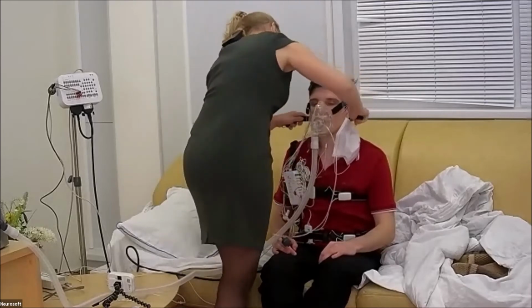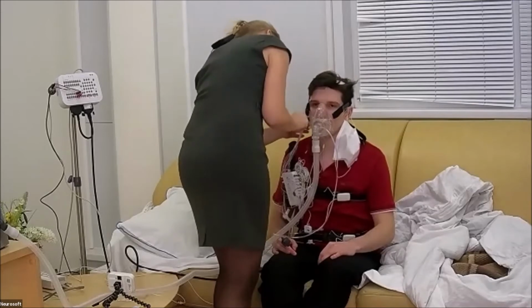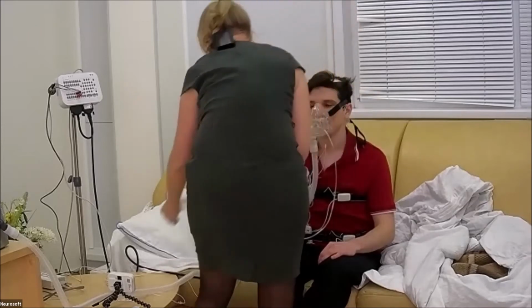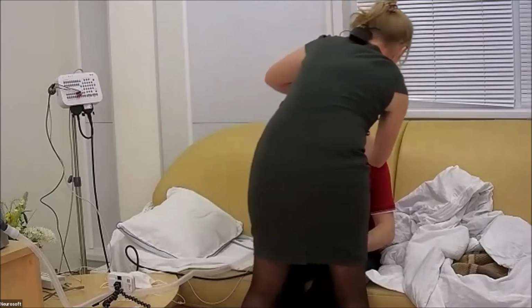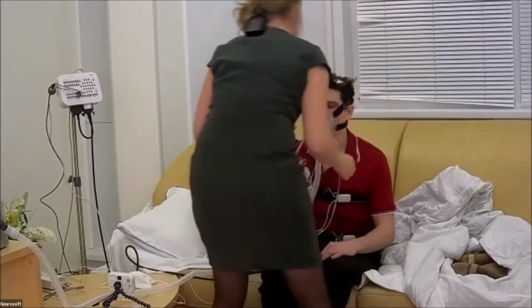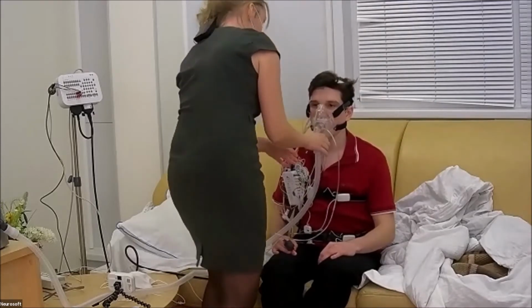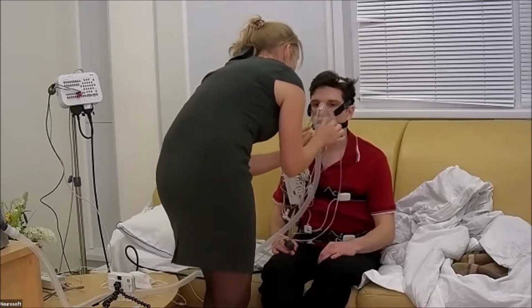So we should fix this mask. I put it here. It's very, very important to have masks of several sizes to find the mask which would be very comfortable for the patient.